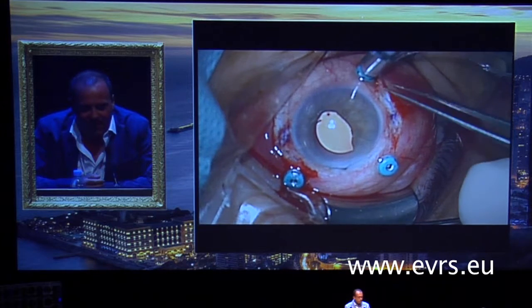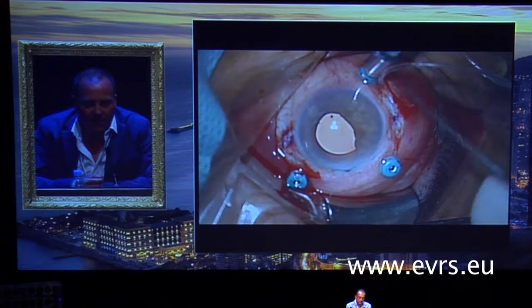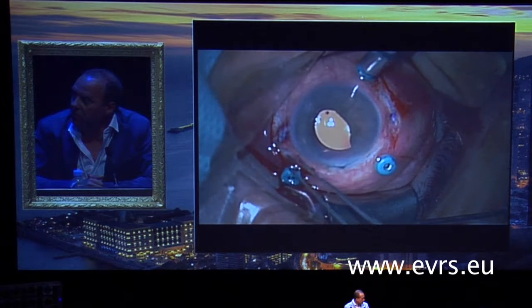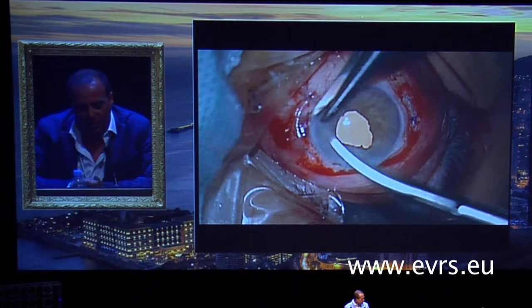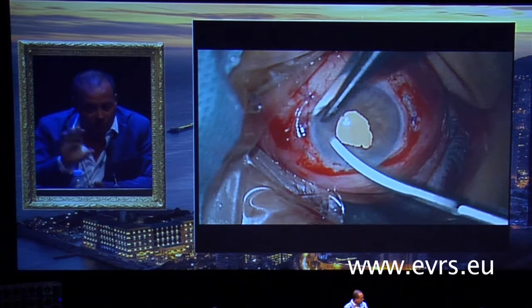So these are nasolacrimal tubes that are used for nasolacrimal surgery. Tube, yes. Great. And so you're using 25 gauge. Yes, for this one, and you created the tunnel initially with the trocar. I only use the 25 gauge trocar for the tunnel and for the insertion into the eye. And that size, did you try with other gauges, 23 and 27, or is 25 perfect?